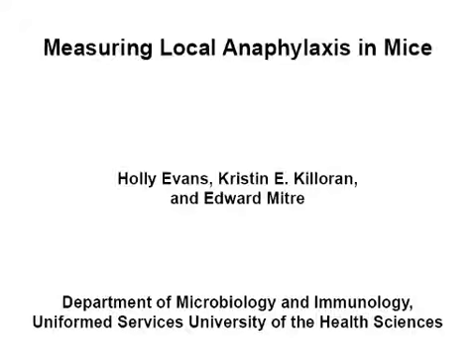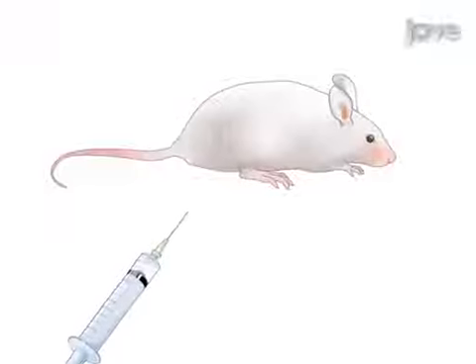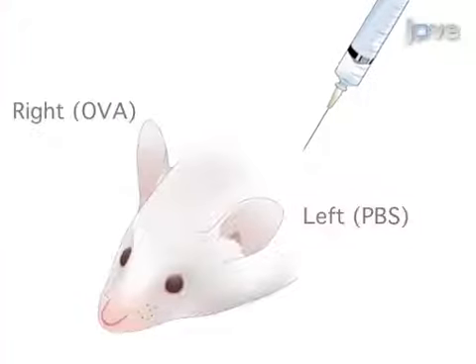The overall goal of this procedure is to measure changes in vascular permeability to quantify localized allergic responses. This is accomplished by first sensitizing the animals to an allergen, such as ovalbumin. The second step is to challenge the ears with an intradermal injection of the allergen.